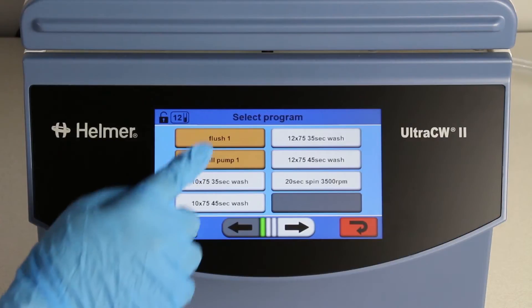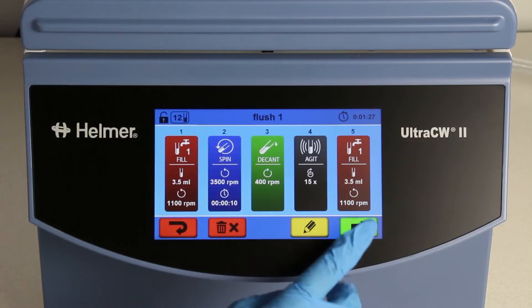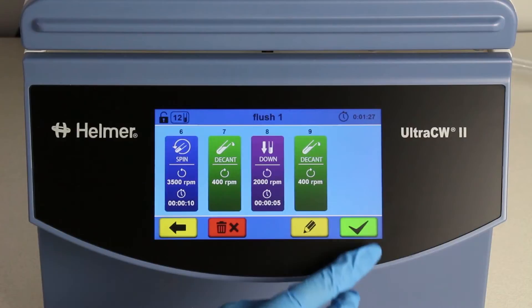Select and run the FLUSH-1 program. When it is complete, wait 5 minutes to allow the disinfectant to work properly.